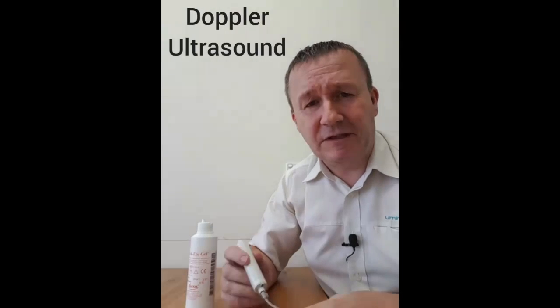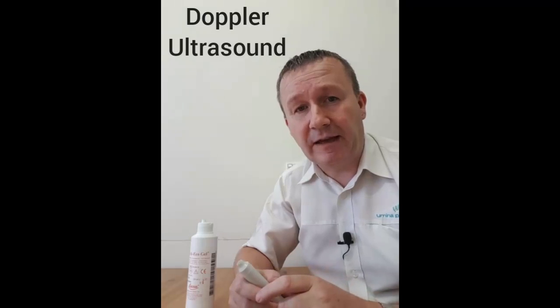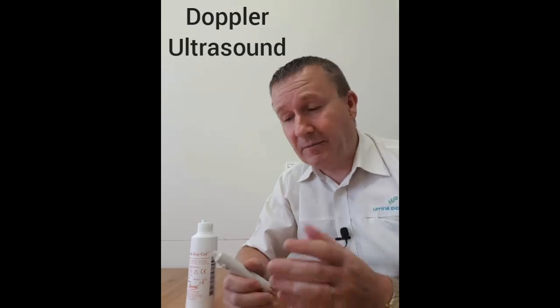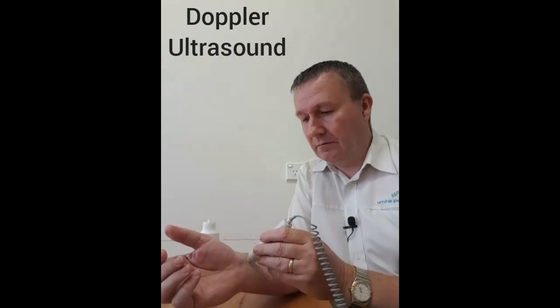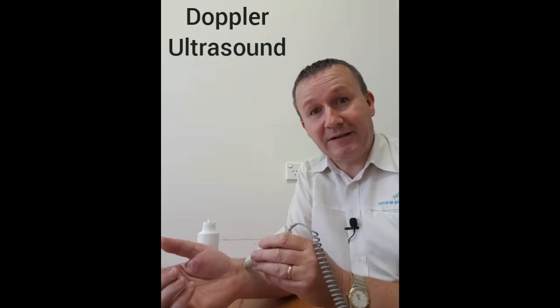You might have had ultrasound scans done at other times to check the circulation, or to have a look at your heart, or if you've ever been pregnant you might have had an ultrasound scan to listen to the baby's heartbeat. We use this to check circulation in your feet. Sounds alright to me.